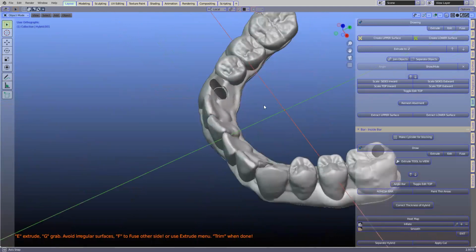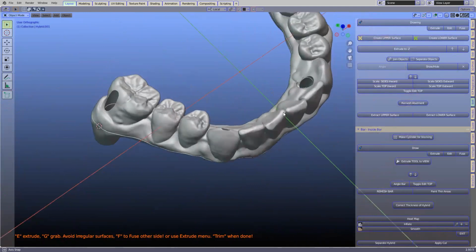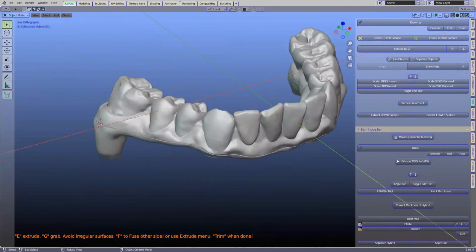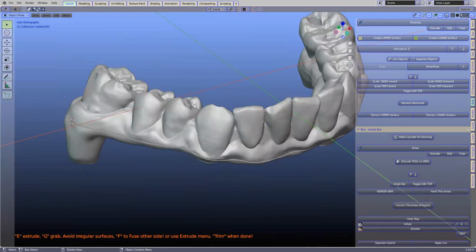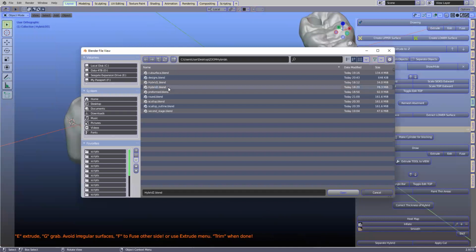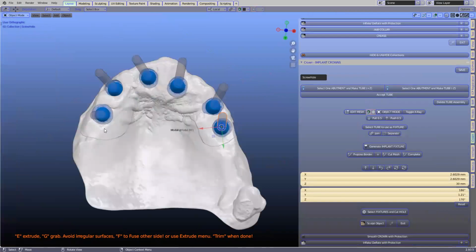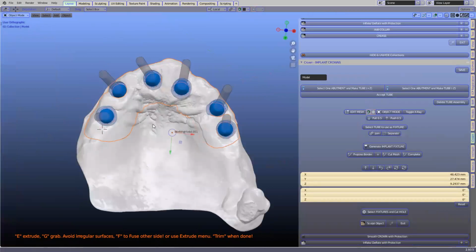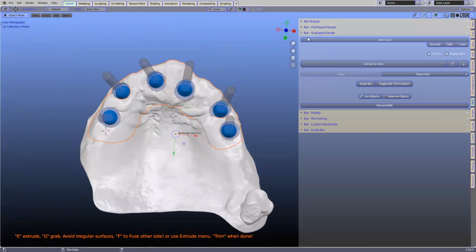I mean, I suppose you can do that. Just think about that. You know how you made those divots, the retention, we could reverse that to make an actual screw thread. And then you can have the counterpart in the actual. I wonder if, yeah, just a screw would work, I think.